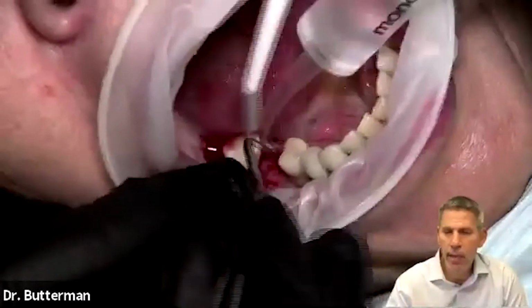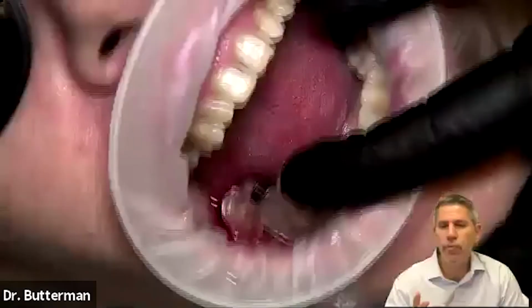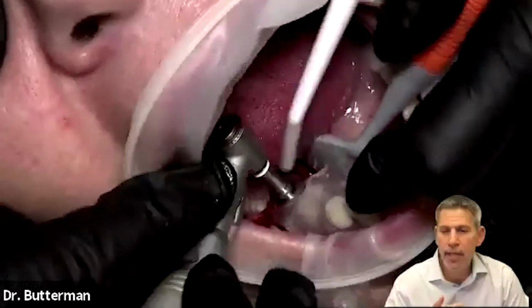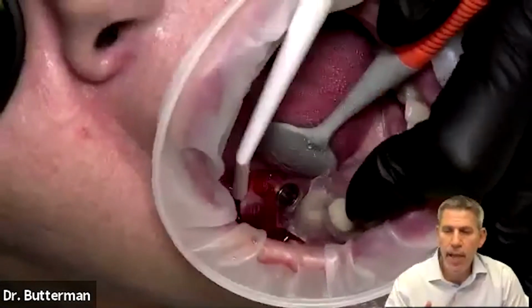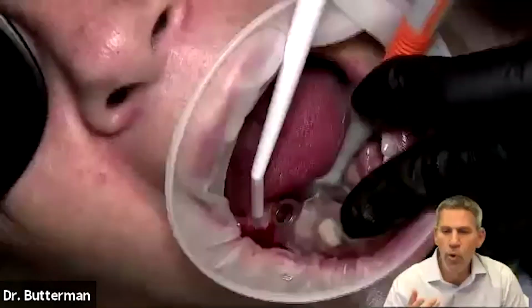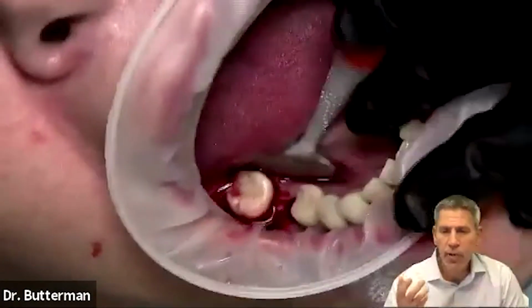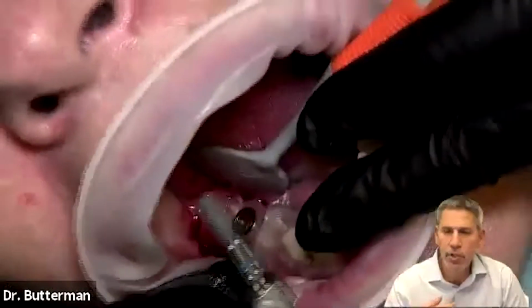And I'm just making my way through the osteotomy. Drill 1, drill 3, and I'm irrigating and cleaning out the osteotomy as we're going through. And then we'll come in with drill 5, and this will end the basic part of our osteotomy. Now I'm going to come back and widen the cortical bone. With this system, you can really fine tune the bone and have the torque exactly the way you want. I'm just removing a little cortical bone, and her bone was relatively dense, so I'm using an optional drill just to widen the apical third just a bit.